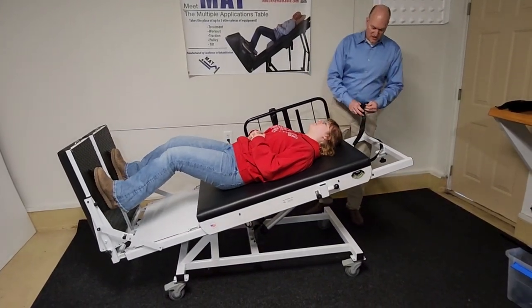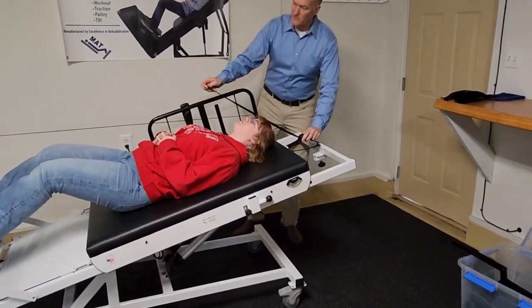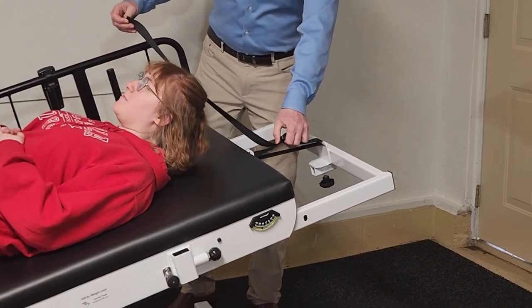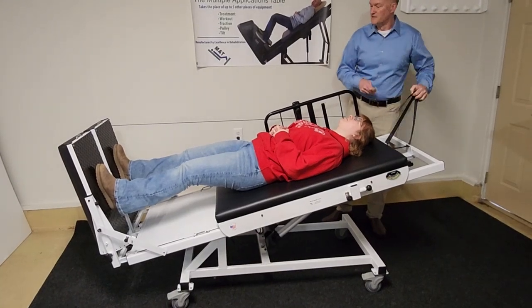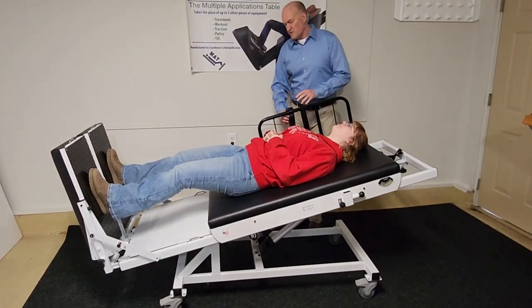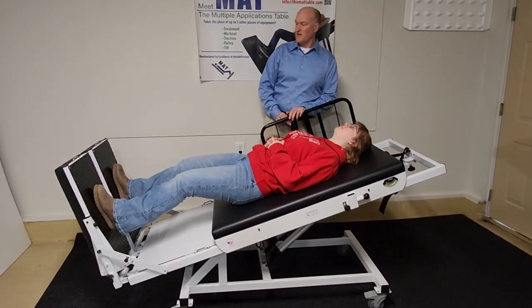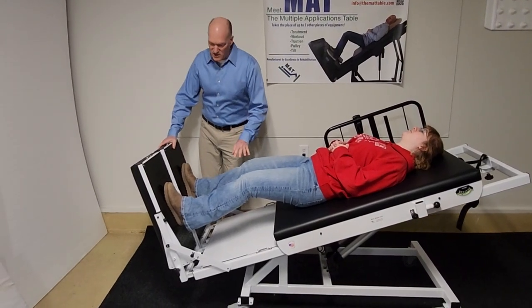There's a flexion control right here which you can use — bend your knees to limit that knee bend and then straighten them out again. You can adjust that to whatever you like. This goes up to 45 degrees, which is 88% body weight. That's the best in the industry for a gravity-resisted incline squat machine.